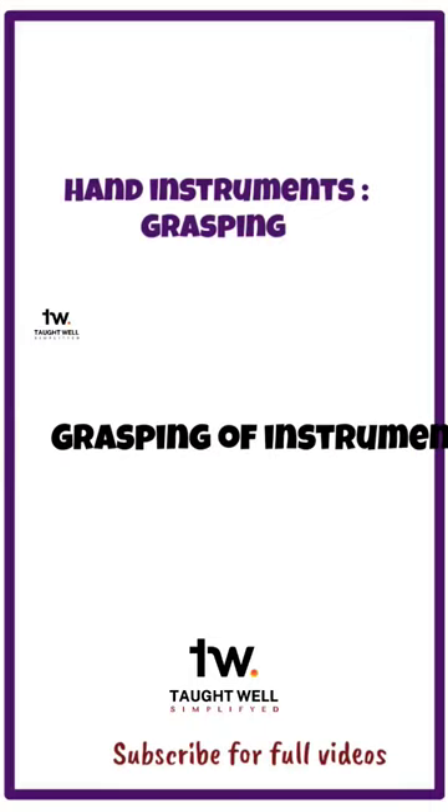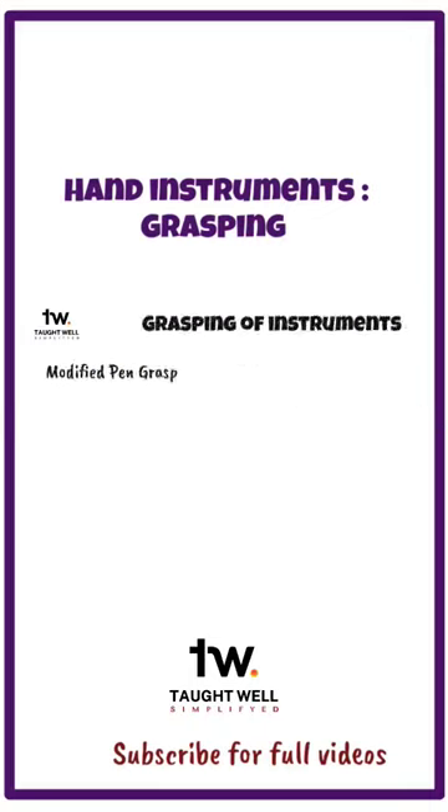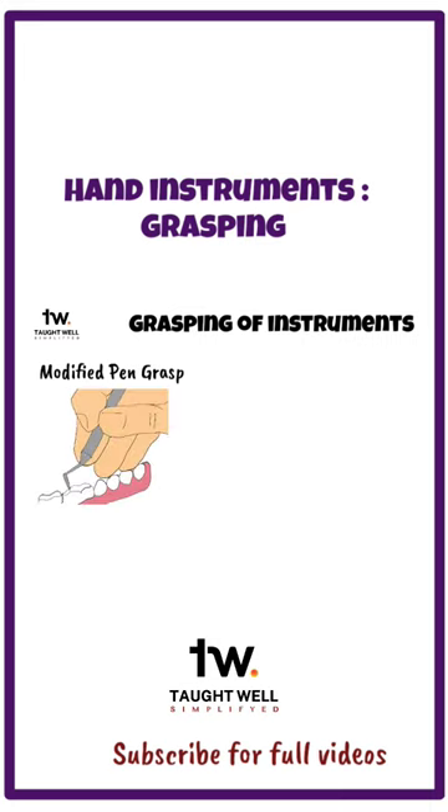To use an instrument correctly, we must know the proper way of holding it. Modified pen grasp is the most commonly used grasp, and it provides the best tactile sensation.